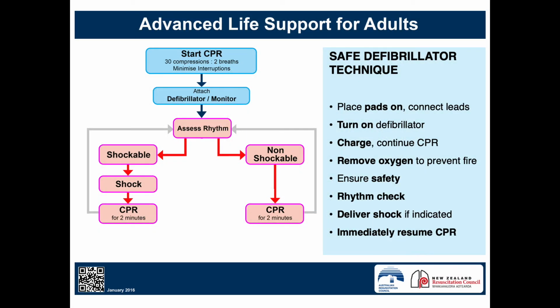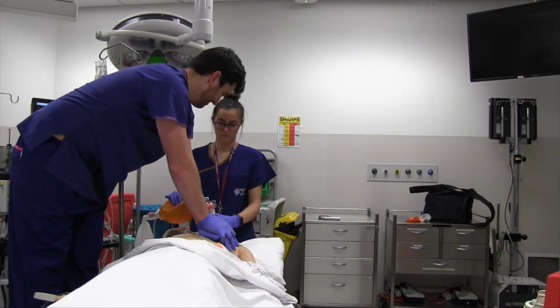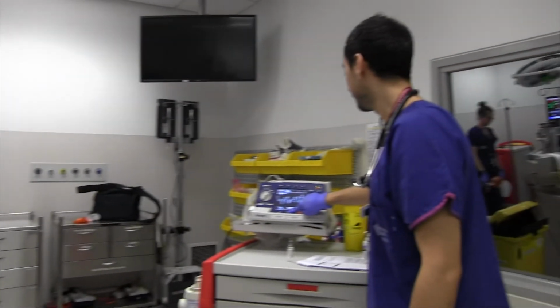The priorities during defibrillation are to minimise interruptions to CPR and deliver a shock of adequate energy to restore a perfusing rhythm whilst maintaining a safe environment. The resuscitation team will now demonstrate the safe operation of a defibrillator. Compressions continue, oxygen away, everyone else stand clear. Charging.